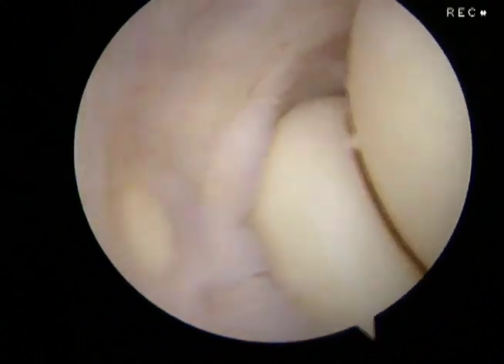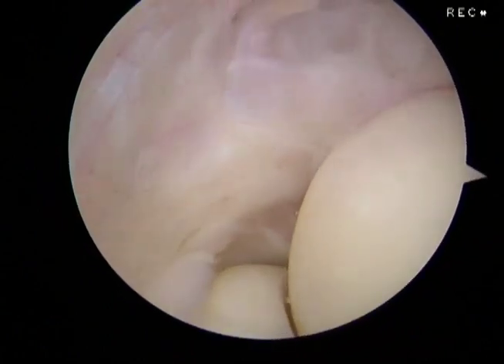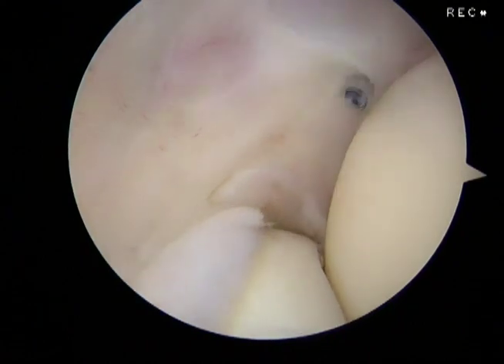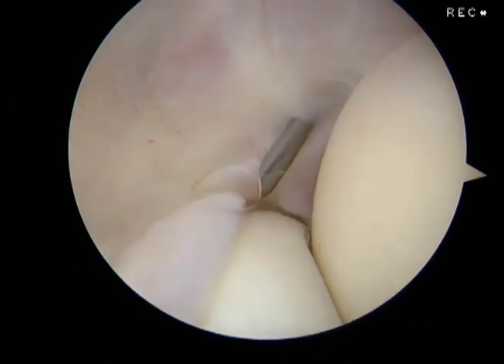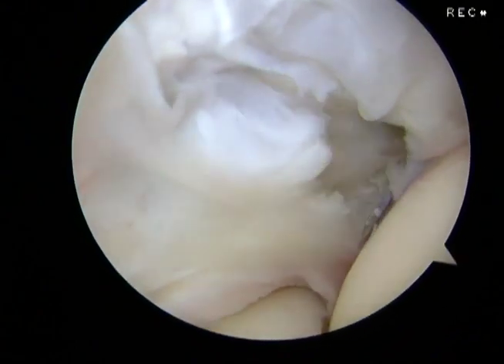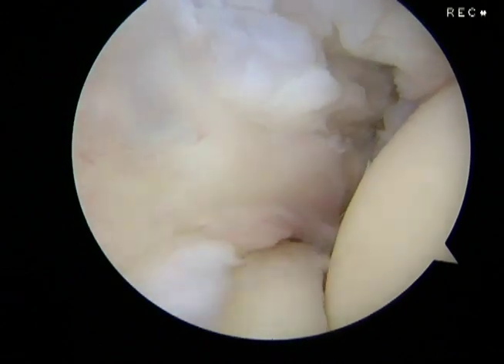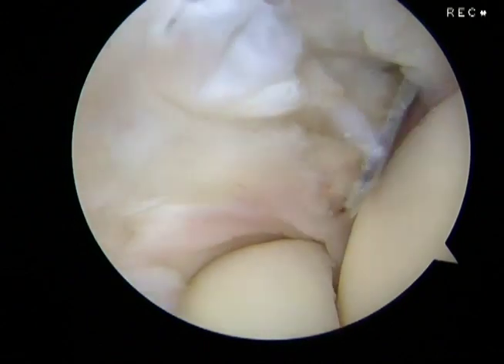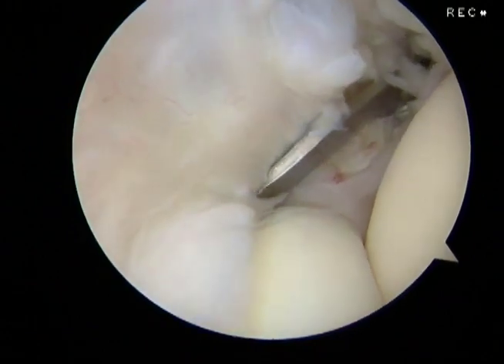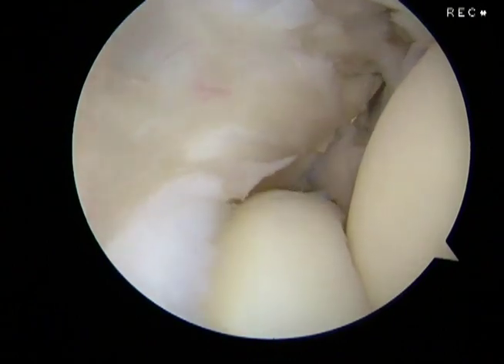Several examples of Baker lesions identified in patients undergoing arthroscopic lateral epicondylitis release are shown, such as in this left elbow with an intact capsule, or type 1 Baker lesion. A spinal needle is brought in for arthroscopic lateral epicondylitis release to localize a tennis elbow portal, and then a knife is percutaneously advanced, releasing the ECRB from its origin and incising the lateral capsule as shown.